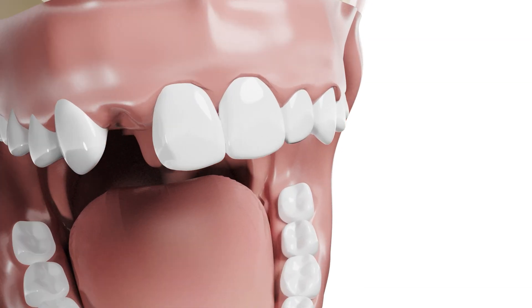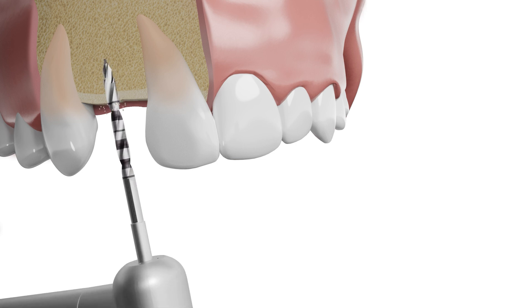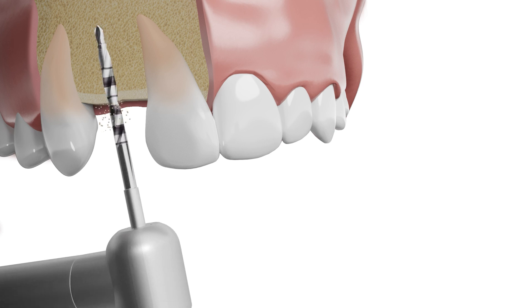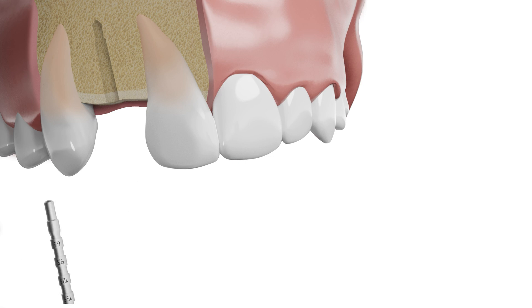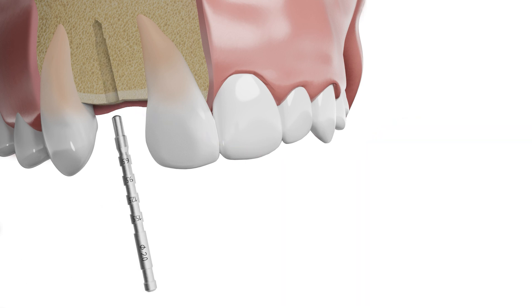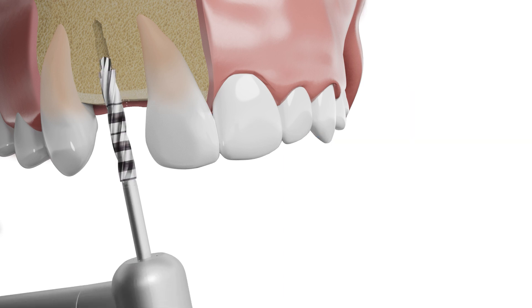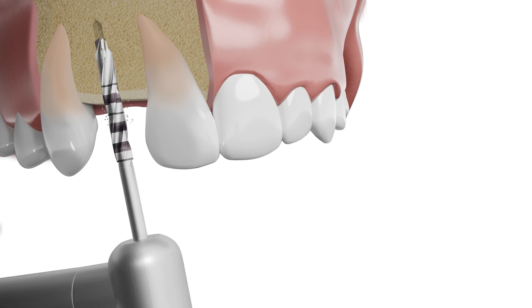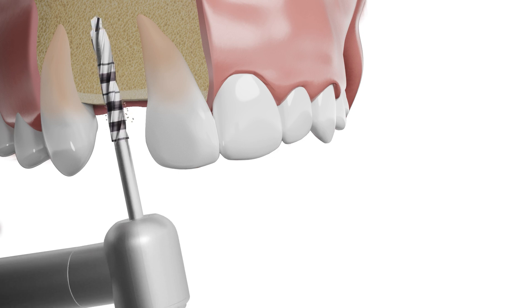Start by using the Vecta Drill Pilot Drill to accurately define the drilling axis and drilling depth. For a subcrestally placed implant with an endosseous length of 11 millimeters, you will have to drill to a depth of 12.5 millimeters to ensure enough space for the machined collar. Use the corresponding depth gauge to confirm the drilling depth. All Vecta Drills feature a tapered tip that corresponds to the diameter of the preceding drill, thereby preventing slippage and ensuring a precisely shaped implant bed. Continue with sequential preparation using the Vecta Drill Twist Drills until the desired diameter has been reached.